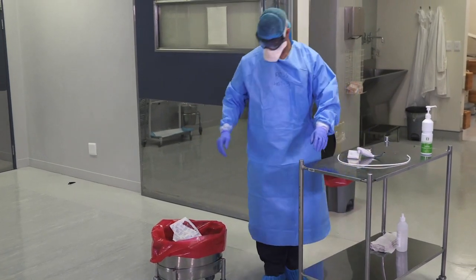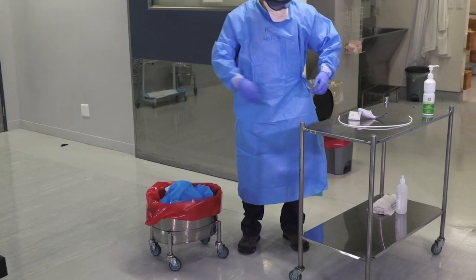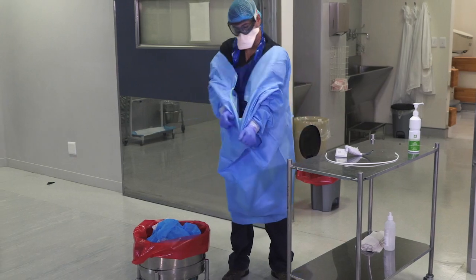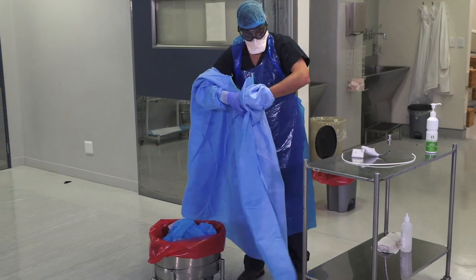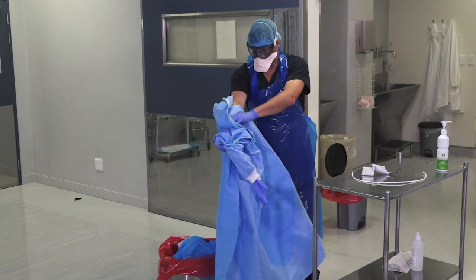You can now start by taking off your boots and then your repellent gown and outer gloves. Untie the tie and put it away from your chest, only ever touching the contaminated surface with contaminated gloves. Make sure your outer gloves come off with the sleeves.